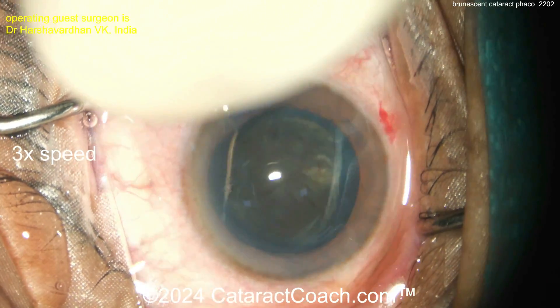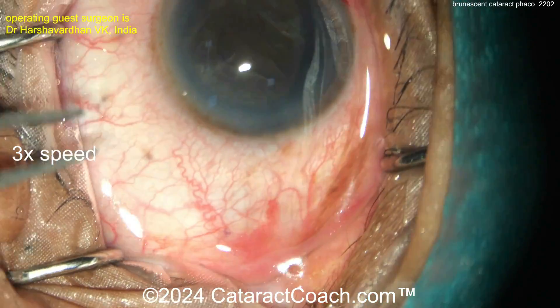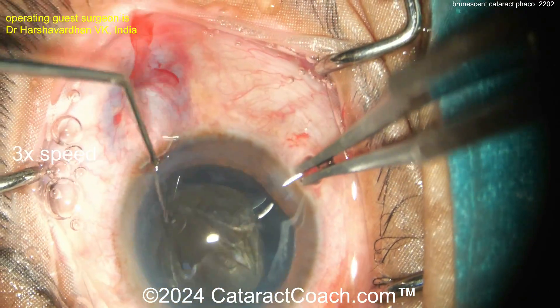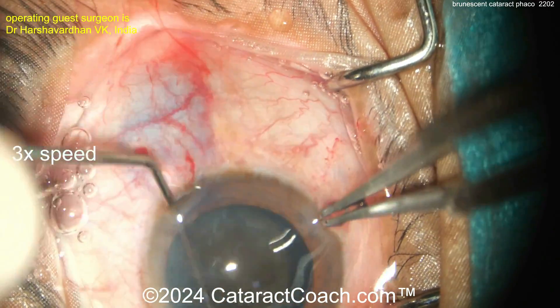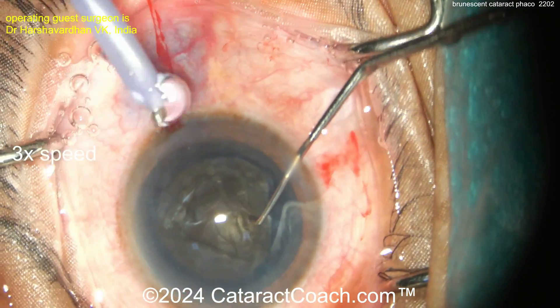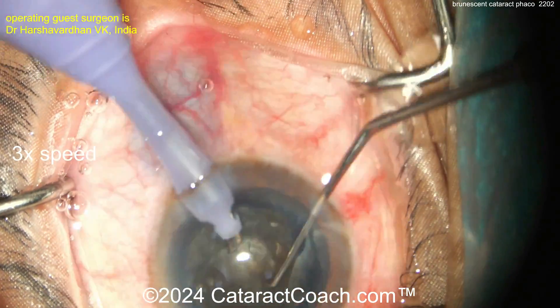This patient has hand-motion vision and definitely needs to become pseudophakic. A little pair of Kelman forceps going in — we'll rotate that nucleus. It is definitely dense. More viscoelastic, and here comes a chopper with the phaco probe.